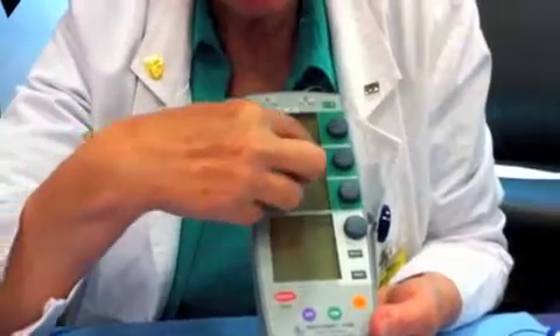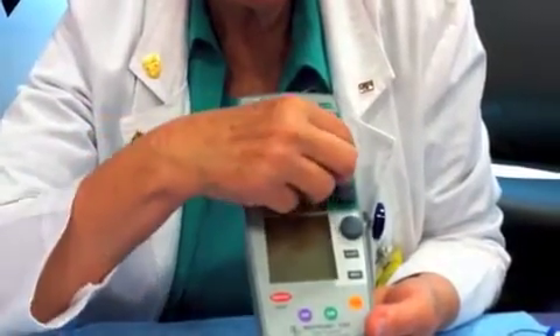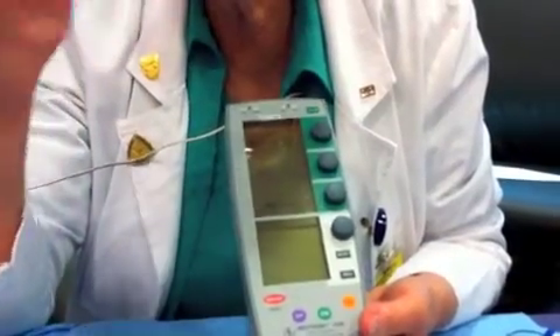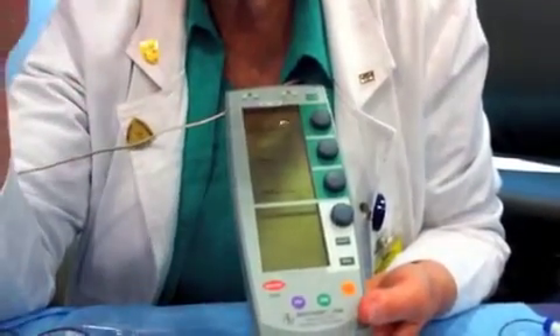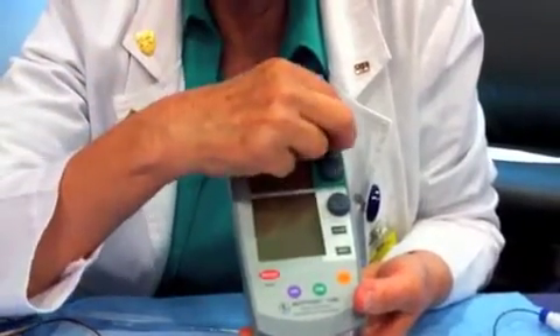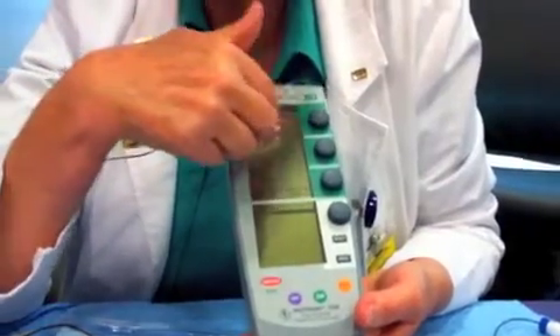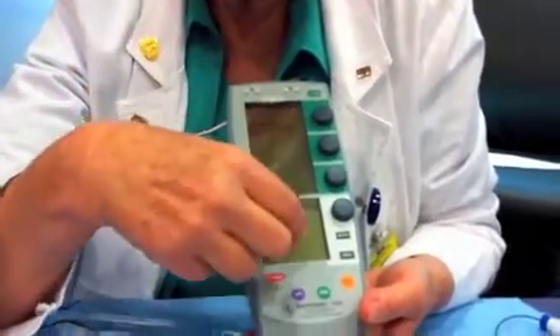The next line is the atrial output. Since this pacemaker is not going to sit in the atrium — it's going to sit in the ventricle — we don't really care about the atrium, so we're going to shut it off by turning it counterclockwise.